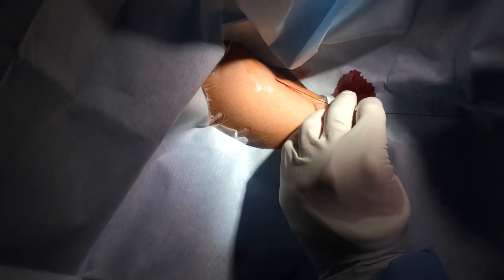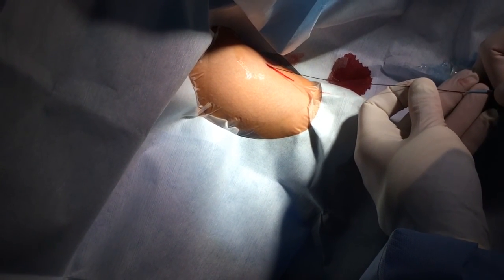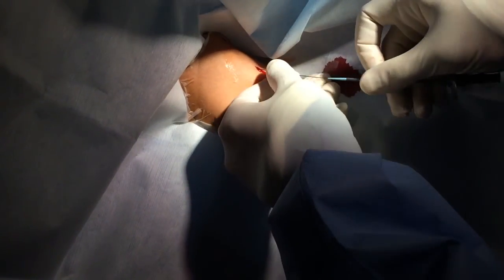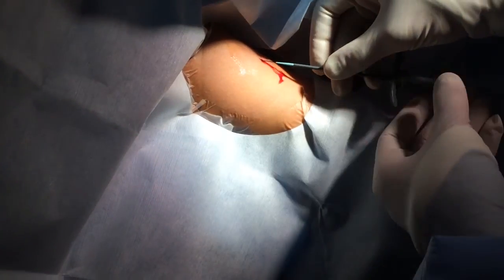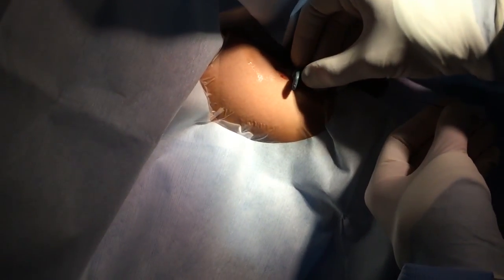Here comes the dilator. And again, I'd give the other half of the lidocaine here right above that wire where we're going to push against the skin with that dilator. He's holding the wire right close to the skin, pushing the dilator in, pushing it in, pushing it in. Went nice and smooth. No interruption that would make you think you're kinking. Otherwise, you could rack the wire back and forth. Out comes the dilator. Cover the hole.